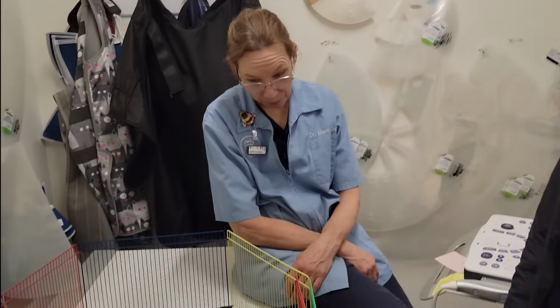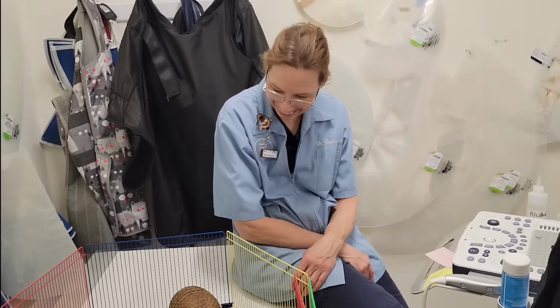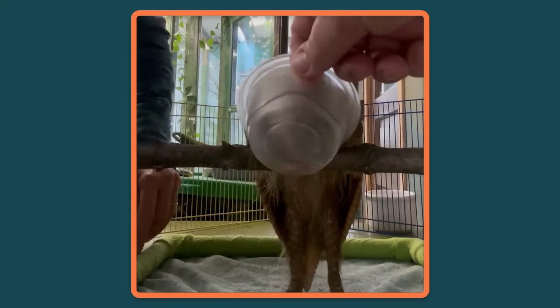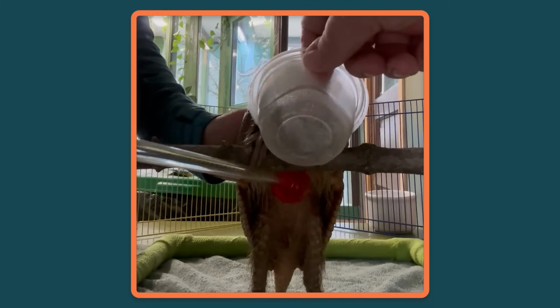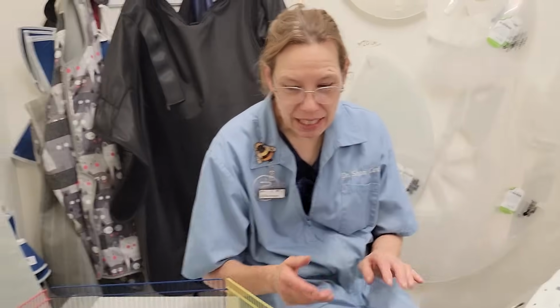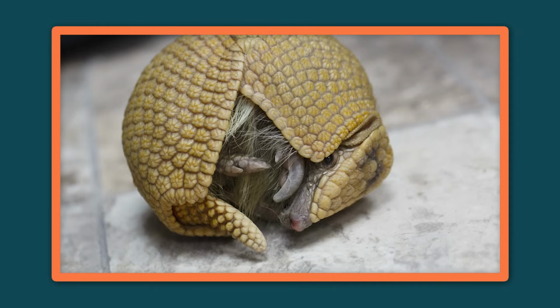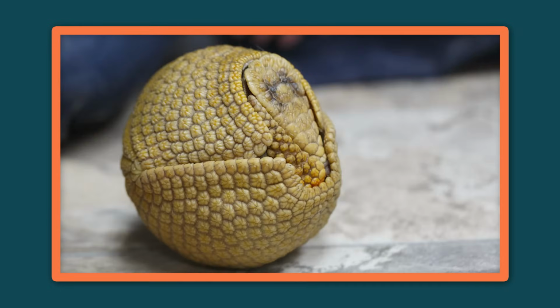Have you ever done an ultrasound with an armadillo before? Nope. What did you think about when we were like, hey, we'd like to do this? Well, the whole point is to be able to get at her little tummy. In the past, when we had to look at the male and look at his tummy, he rolled himself up in a little ball, and you couldn't really see anything. It was really hard to work on him.